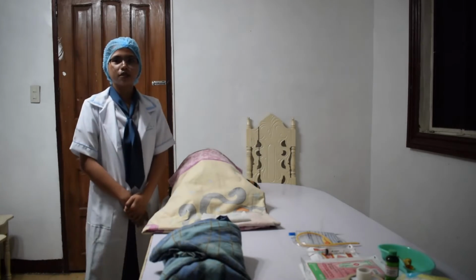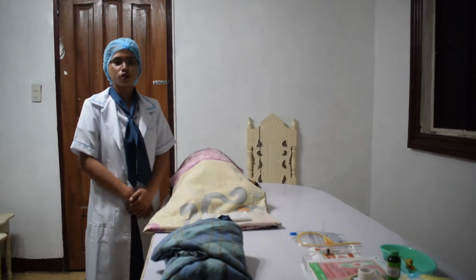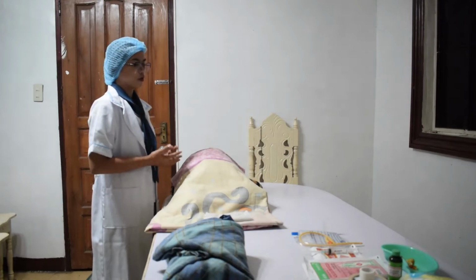Good day, ma'am. I am GSDMSFI ASAT BSN2C. Now, I will demonstrate to you how to insert a catheter for our female client.